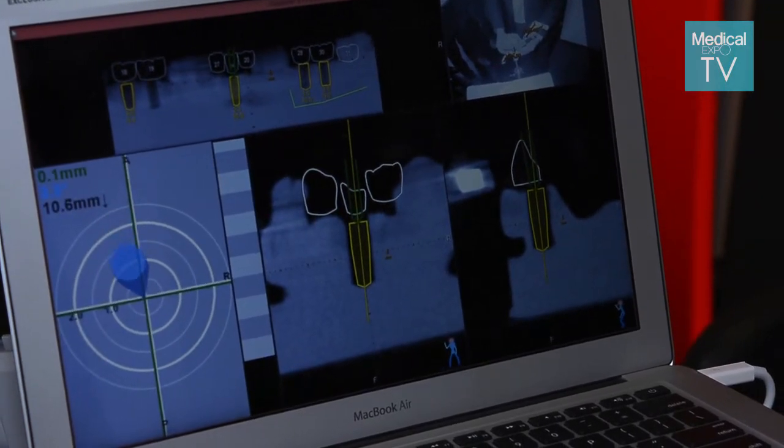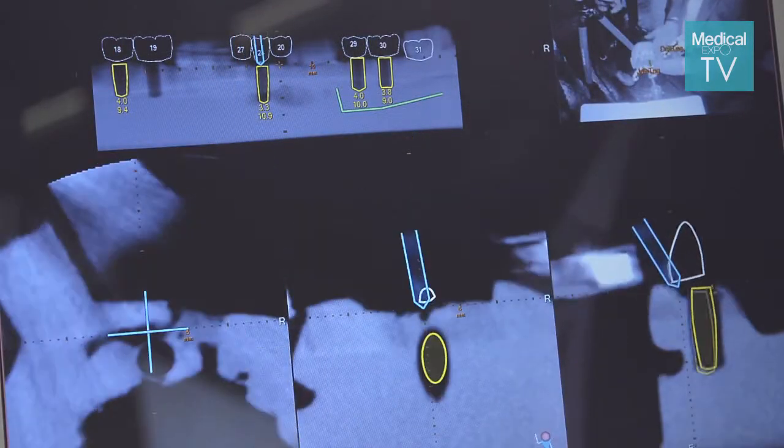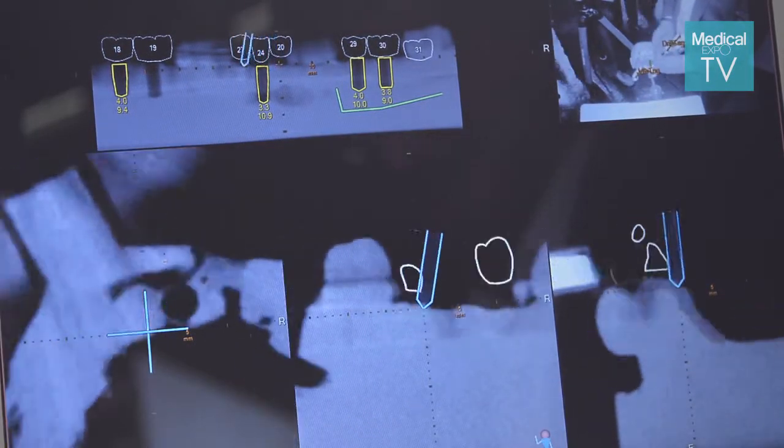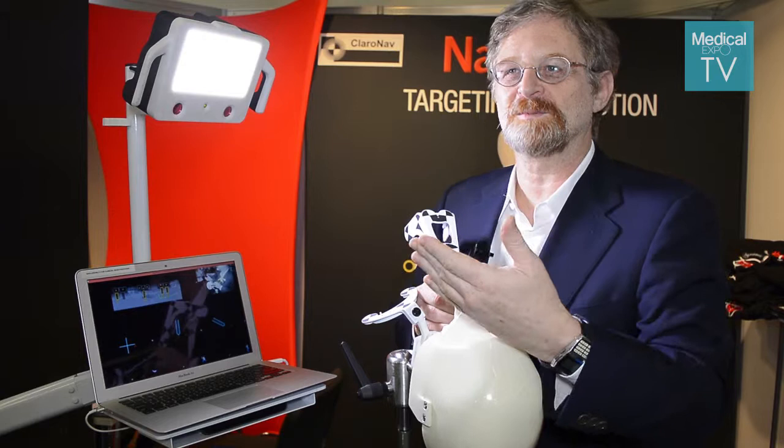Our system has an accuracy of about 0.5 mm, which is much higher than what can be achieved without the guidance. So when the work is done, the implant is placed at the correct location, correct angle, and correct height to make the restoration of the final crown much closer to perfection.